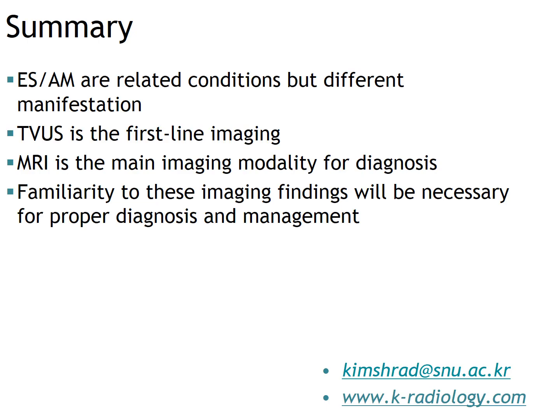In summary, I would say endometriosis and adenomyosis are closely related conditions but different manifestations. Transvaginal ultrasound is the first-line imaging, and the MRI is the best imaging modality for diagnosis. And familiarity with these imaging findings will be necessary for proper diagnosis and management.